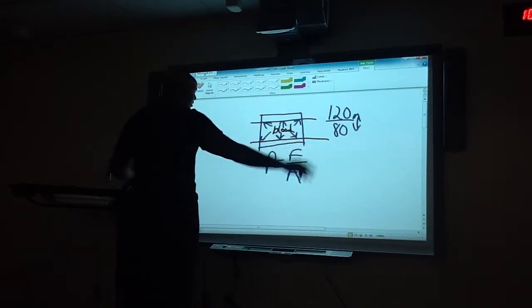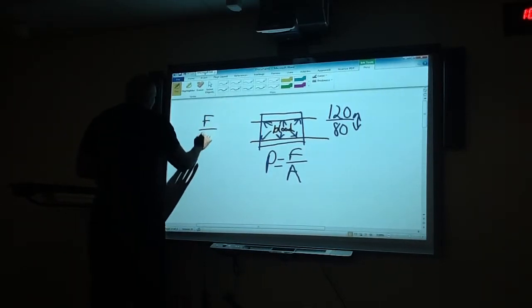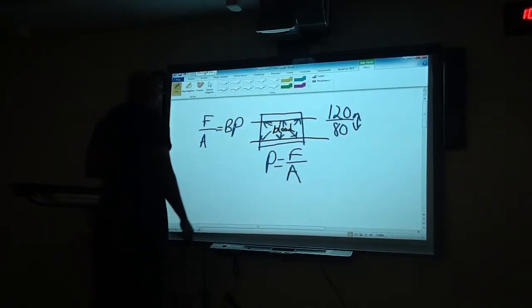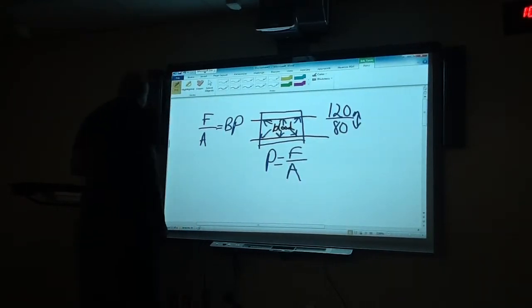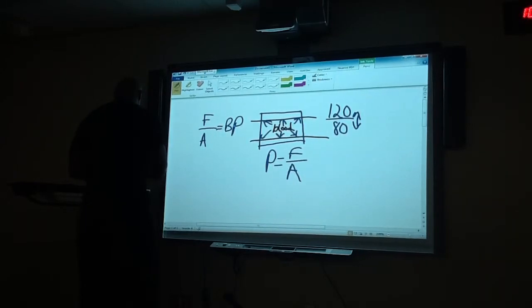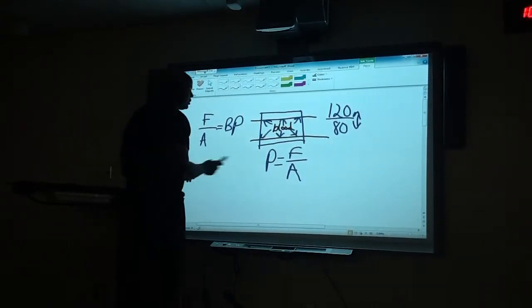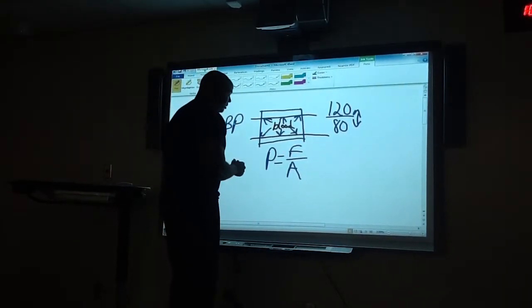So the way that blood pressure is calculated is, again, it's the force over the area equals blood pressure. So using the apparatus to measure the pressure, that's how we get it numerically. So you have a force that's being asserted against the walls and the arteries, and the pressure being measured by the manometer. So that's, in short, in essence, how the manometer gives us the ability to measure blood pressure.